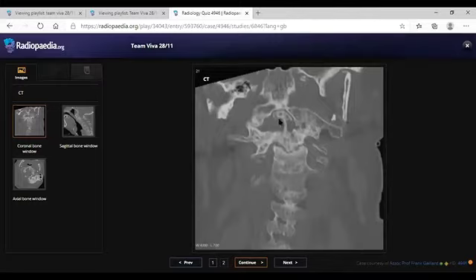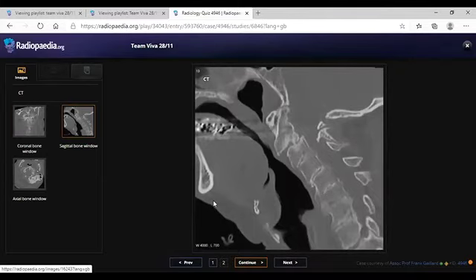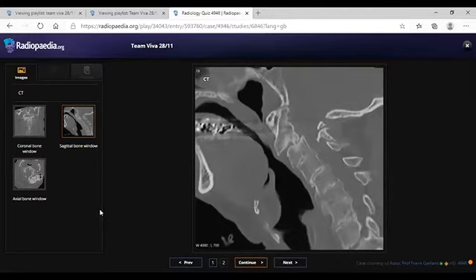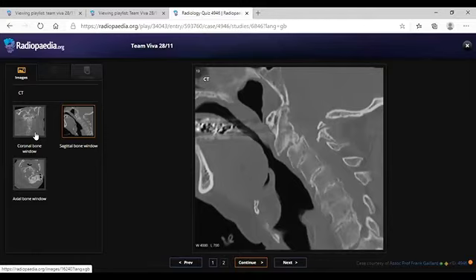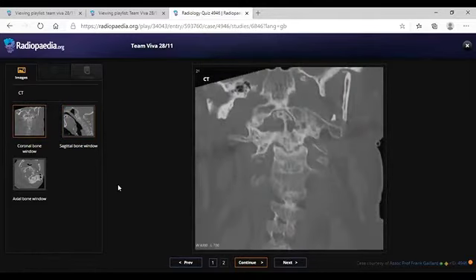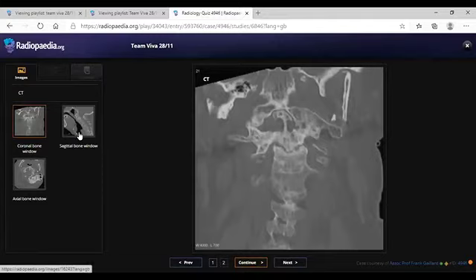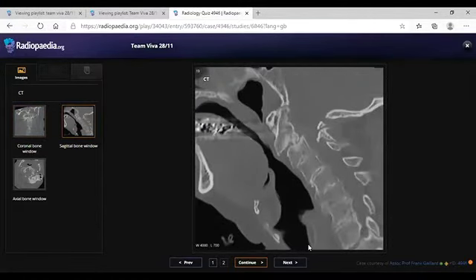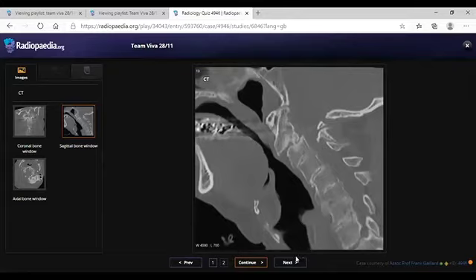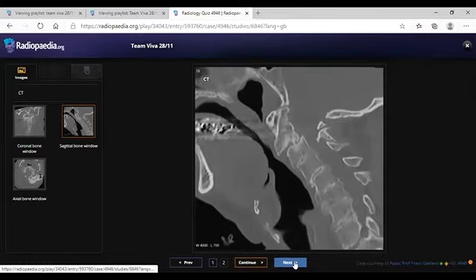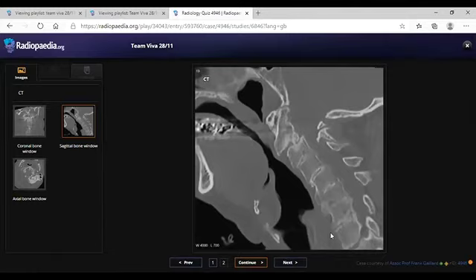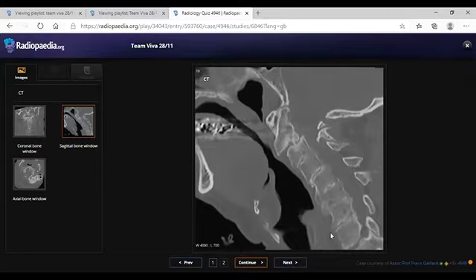Can you give any other differential that could cause these typical erosions of the dens? This appearance is produced by the pannus of rheumatoid arthritis. Another possibility here could be gout, with soft tissue lytic punched-out lesions of gouty tophi. Because there is subluxation at C2-C3 level and possible cord compression, I'll alert the referring clinician regarding the findings. The patient might need emergency MRI and stabilization.